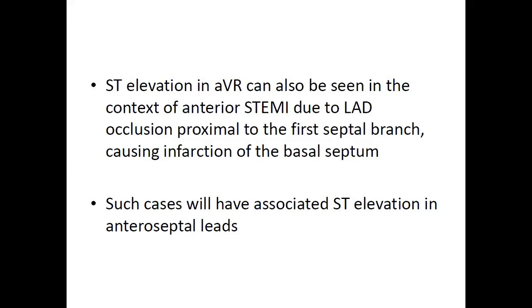ST elevation in AVR can also be seen in the context of anterior STEMI due to LAD occlusion proximal to the first septal branch, causing infarction of the basal septum. Such cases will be associated with ST elevation in the anteroseptal leads.